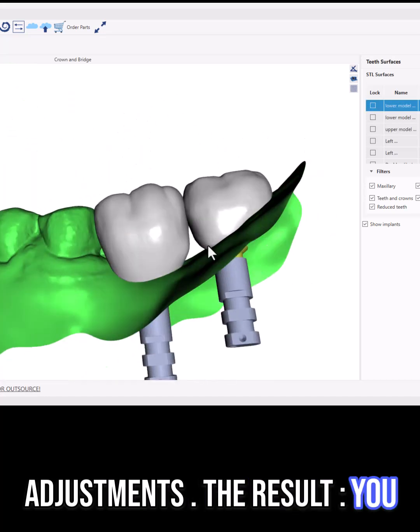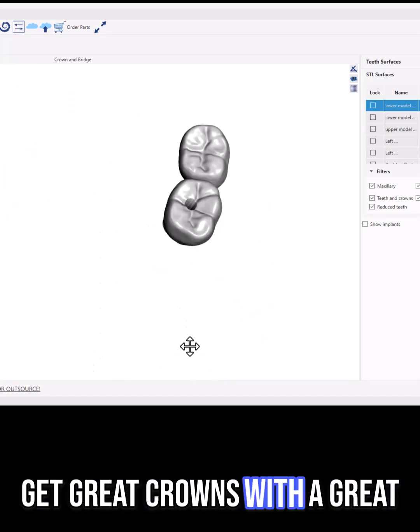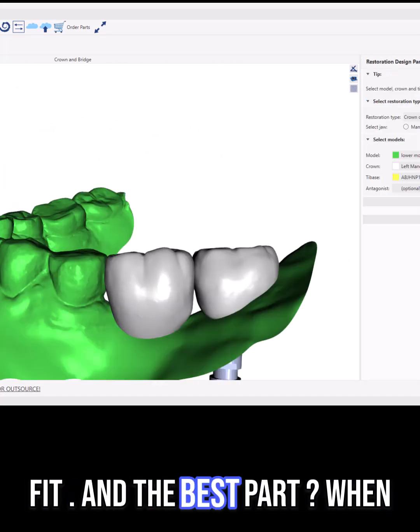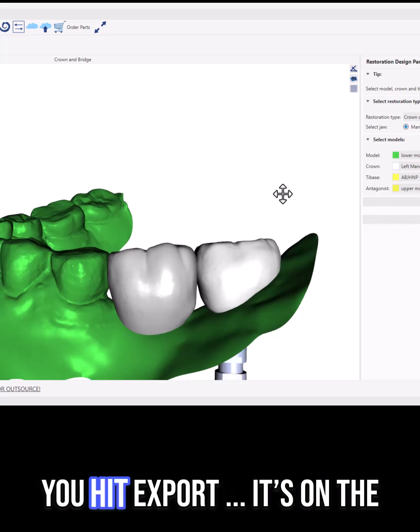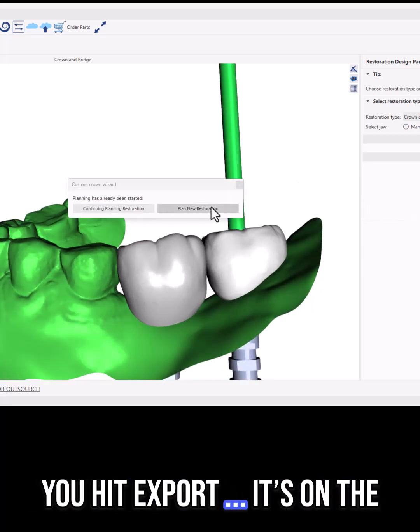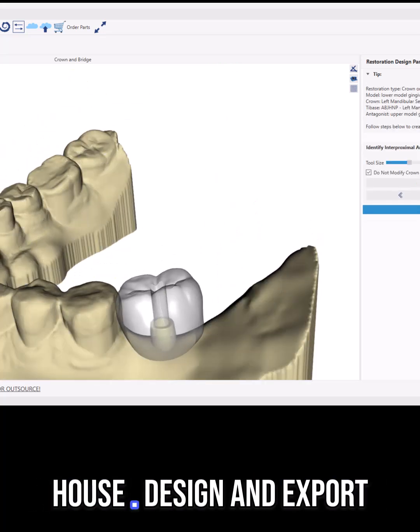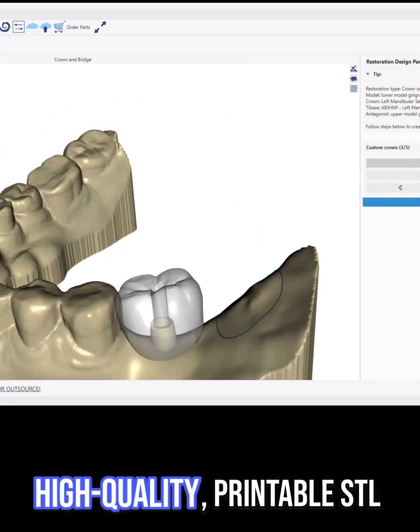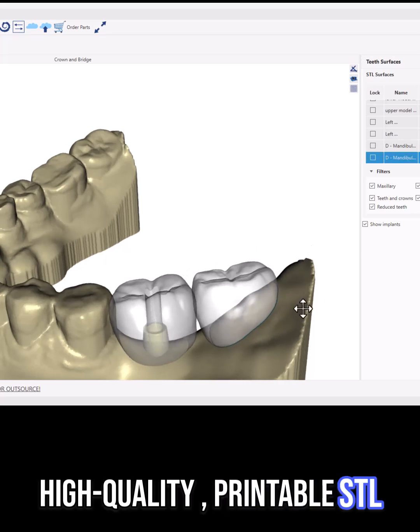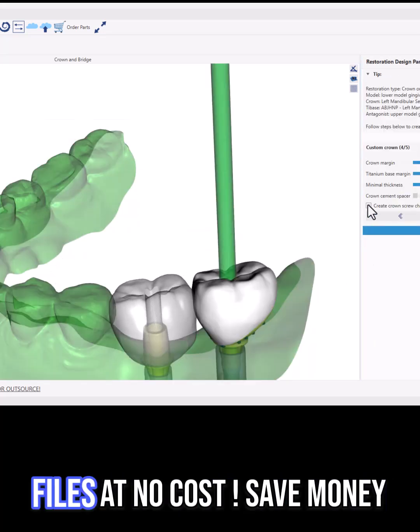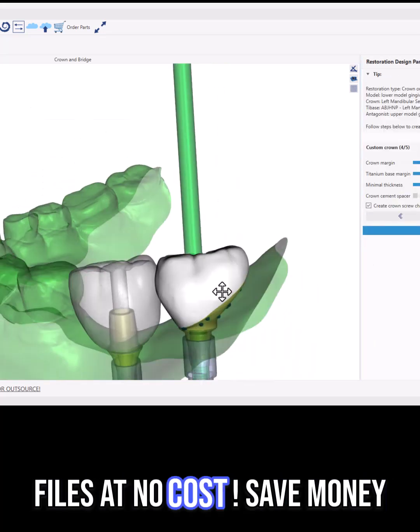The result: you get great crowns with a great fit. And the best part? When you hit export, it's on the house. Design and export high-quality printable STL files and mill configuration files at no cost.